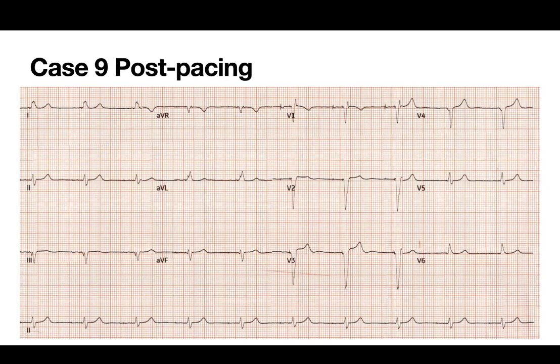the question I want to ask is, if you're seeing a persistent small double peak in aVL, is it for you a sign that you could go a little bit further? Because I find the ones that you really come to the LV endocardium, aVL is monophasic. So if it's remaining a little biphasic, is there some room to go more?